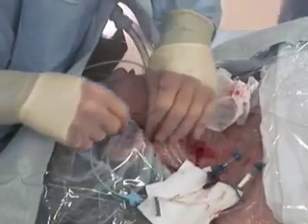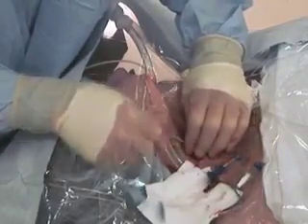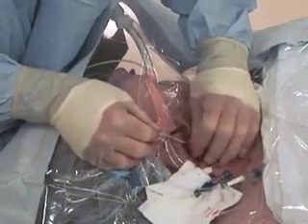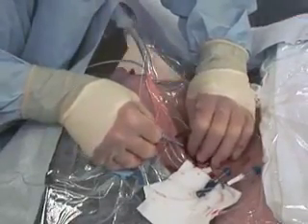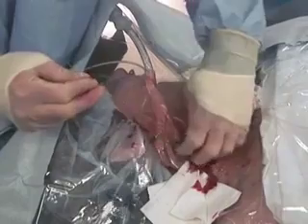Now, feed the catheter over the guide wire, being certain to maintain control of the external end of the wire before advancing the catheter through the skin. This usually requires that the wire be pulled slightly out of the patient until the external end of the wire extends out of the catheter hub, and can be grasped. While grasping the external end of the guide wire, advance the catheter over the wire using a rotating motion.